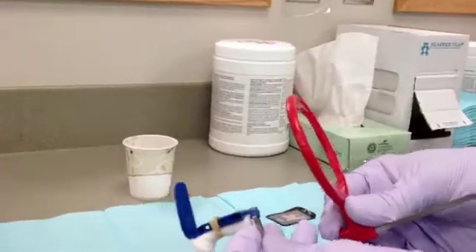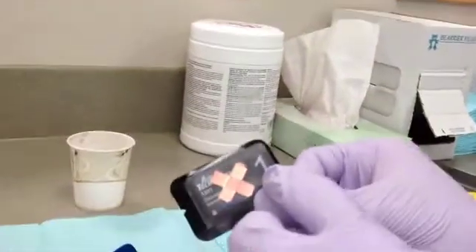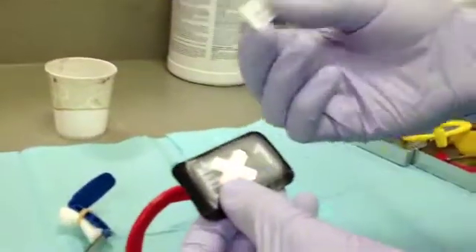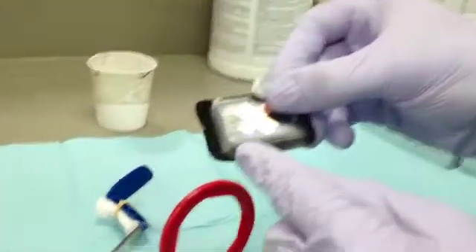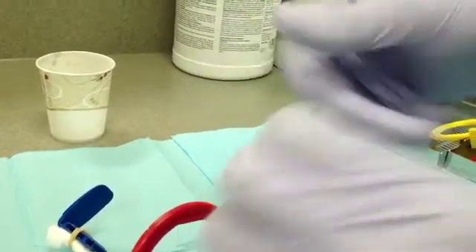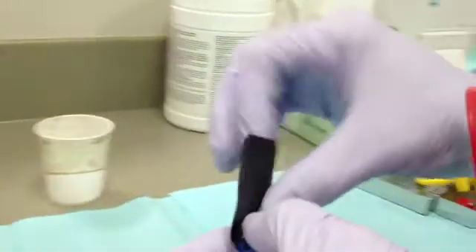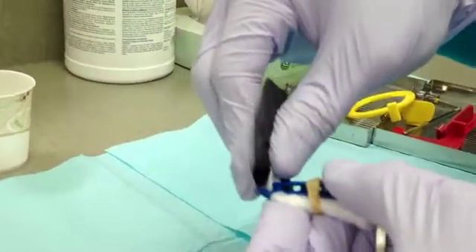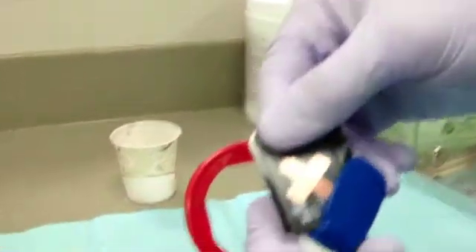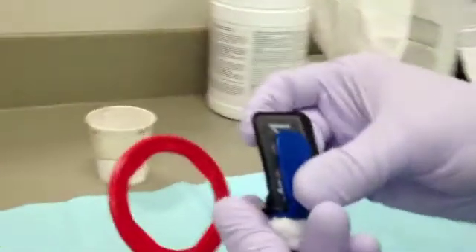At this point, the XCP is ready for the size 1 phosphor plate. Before inserting the plate into the bite block, a sticker should be added to the side of the plate with the A on it. That edge of the plate goes towards the bottom of the bite block. This will increase the thickness of the plate to prevent it from moving in the bite block. When inserting the plate, make sure that the dark side is facing toward the ring and that the X is facing the bite block. Also, the plate should line up with the back of the bite block and be centered standing vertically.